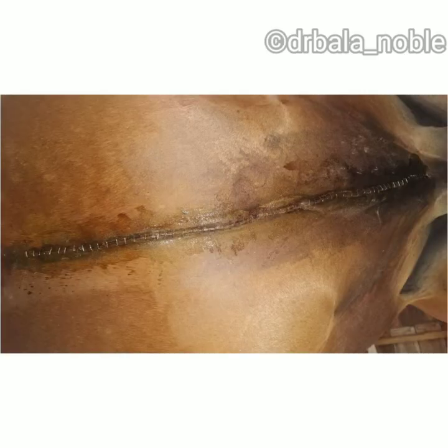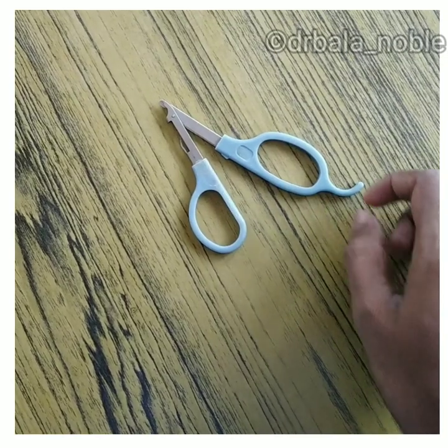This is also a horse c-section. The next advantage is low risk of infection, because the staples won't harbor infection like other suture materials. Other advantages include strong wound closure and minimal tissue reaction.